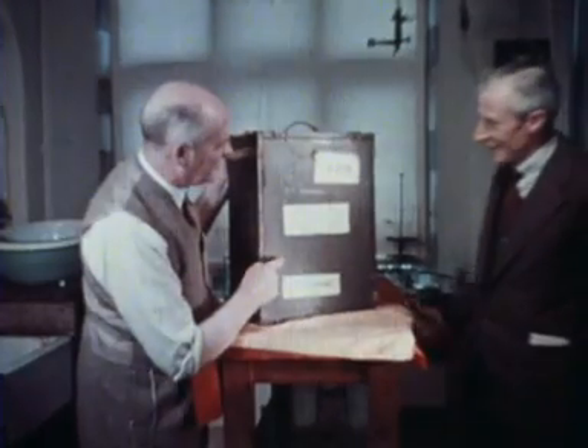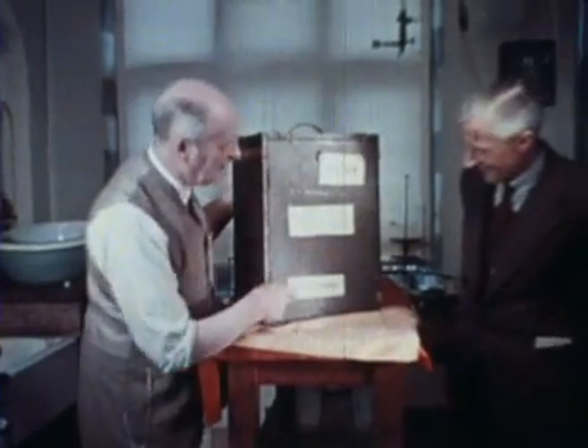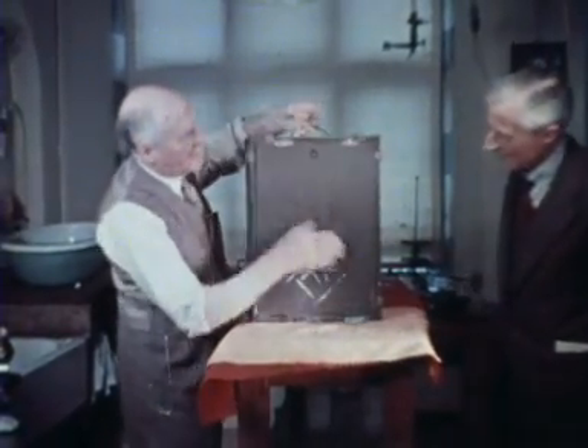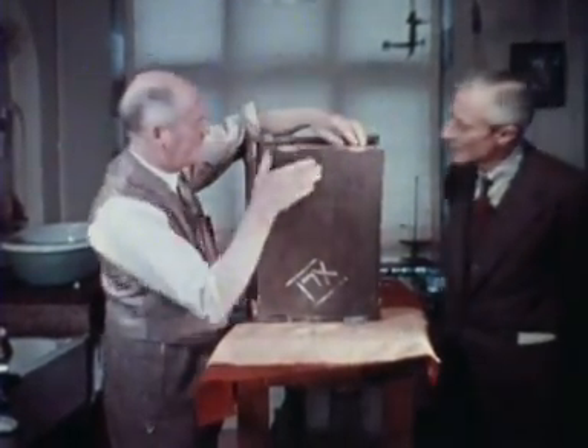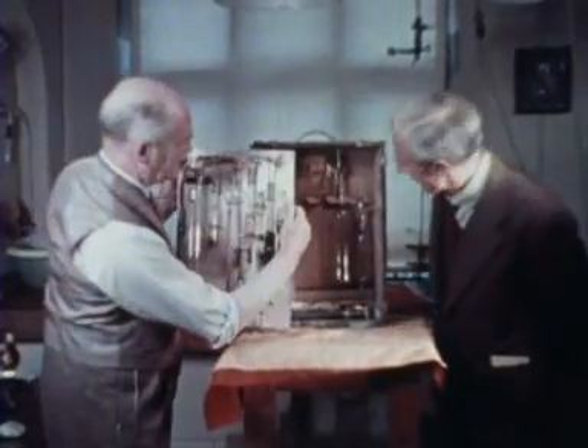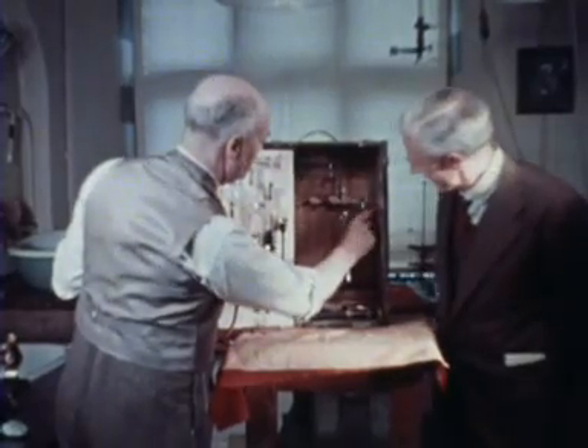Professor Henry Barcroft: When my father led scientific expeditions to remote parts of the world, he had to develop robust but lightweight equipment which he could take anywhere and which could produce a full oxygen dissociation curve from a small amount of blood.